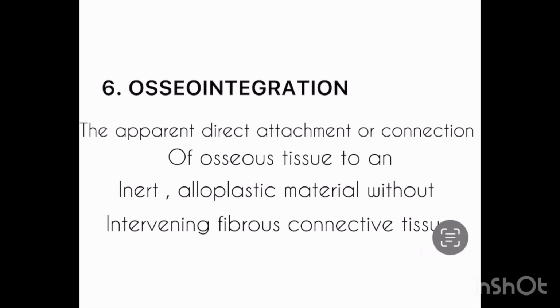Now the sixth step is osseointegration. Osseointegration means connection or attachment of the osseous tissue or bone tissue to the foreign material that is being inserted.